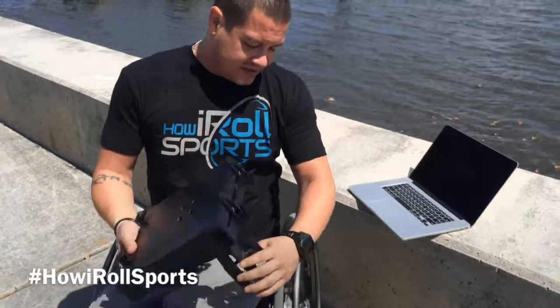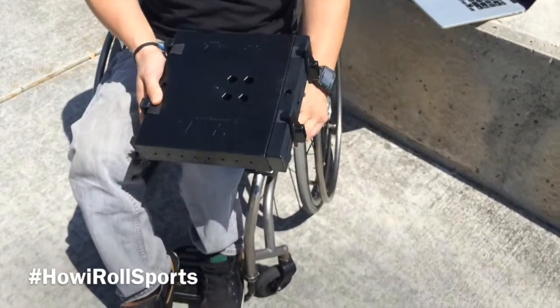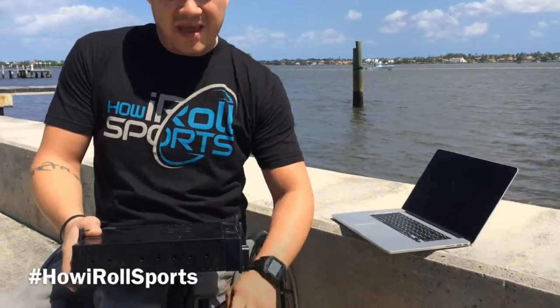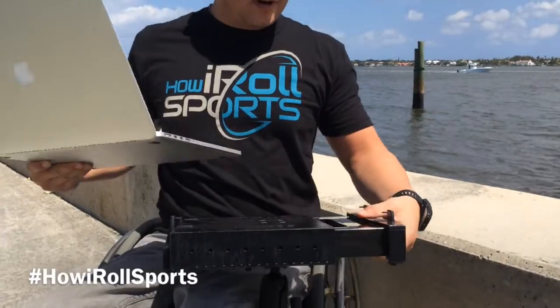Simple to attach. Leave this on at all times. Mount by RAM, made here in the USA — goes on. Take your laptop; any size will work.